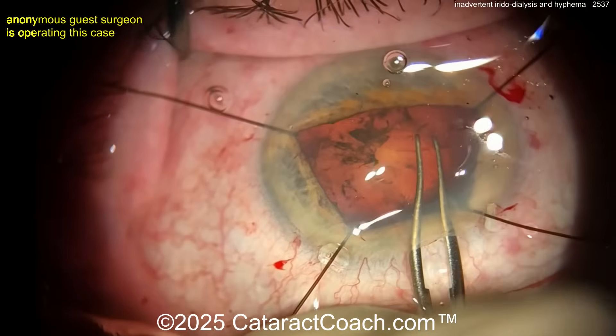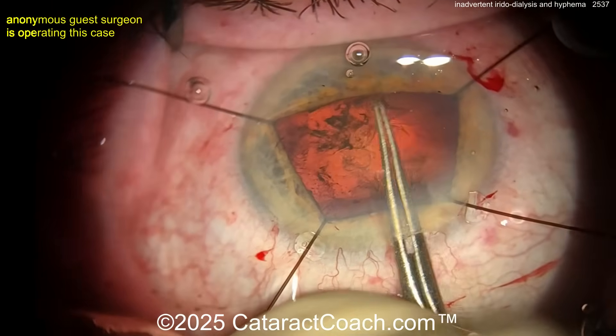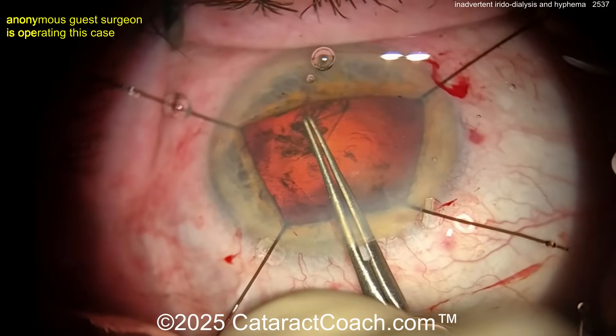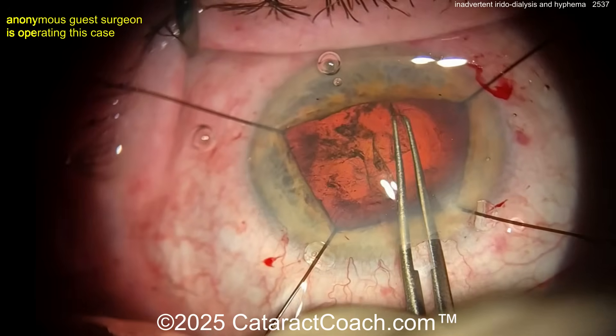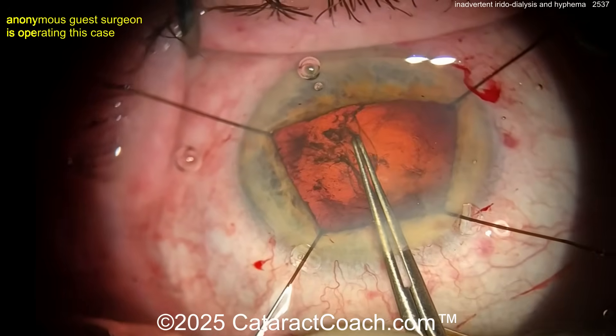So let's get the iris hooks in. Here's the beginning of the case getting the rhexis done — iris hooks are in. I like the idea: if you need iris hooks, use them, no problem at all. In a shallow AC, I think you're better off using iris hooks than using a Malugan ring.